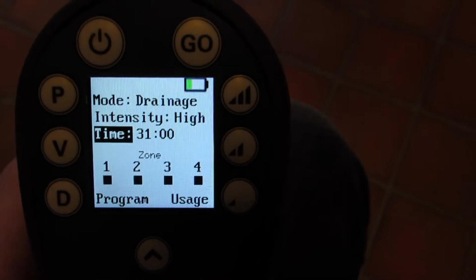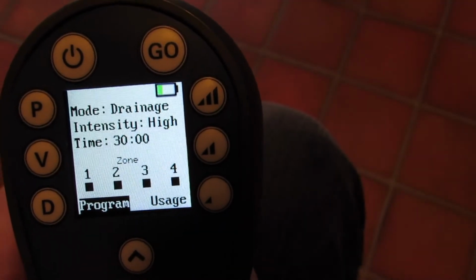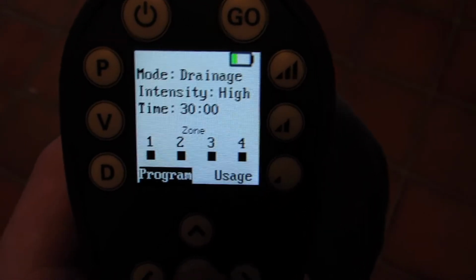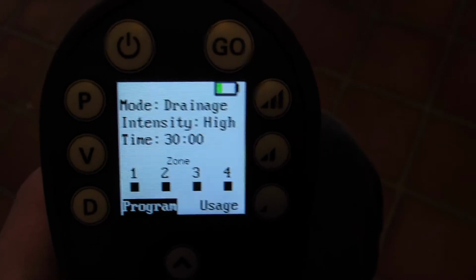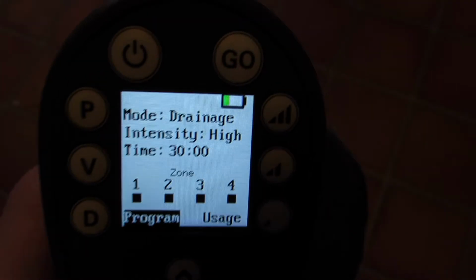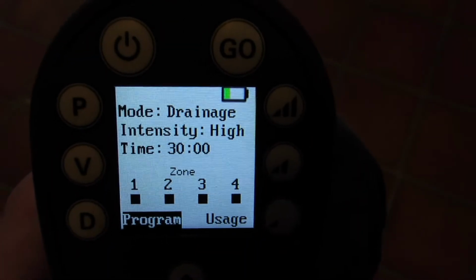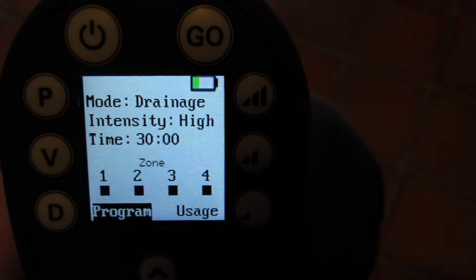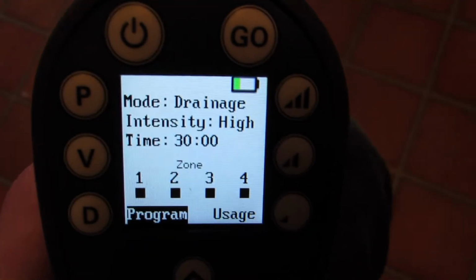Next, you have your time. That's just how long you want your treatment to run. And then down here we have our program. What programming does is it allows you to, again, I hate to keep comparing this to the Hill-Rom vest, but with the Hill-Rom vest, you had the option of programming the vest to where, say, every 10 minutes, it would change the way that the vest is shaking you. It would be faster, more intense, or whatever. This lets you still do that. So say you wanted it to shake you on low settings for 10 minutes, then on medium for another 10 minutes, and then high for another 10 minutes. You could set this to do that. And then obviously you'd have a total of a 30-minute treatment.